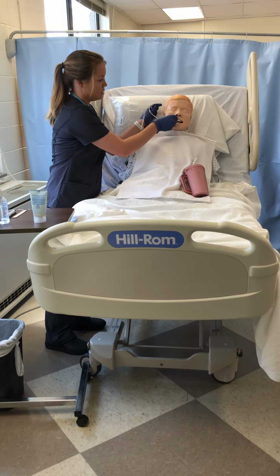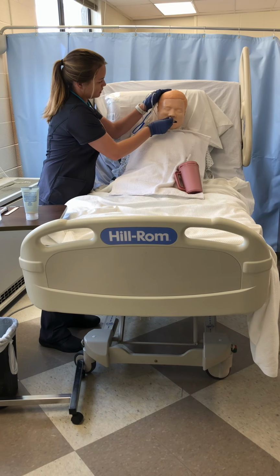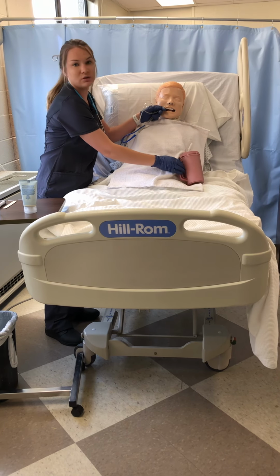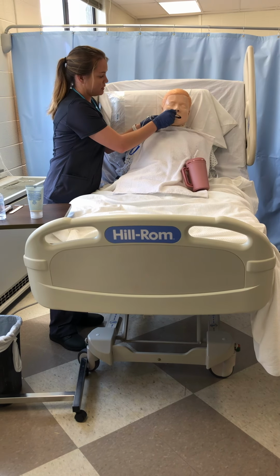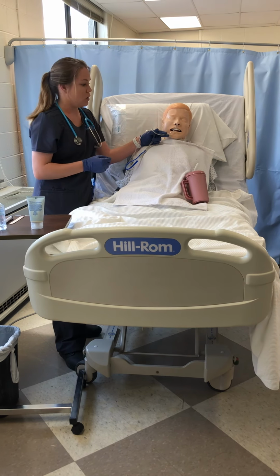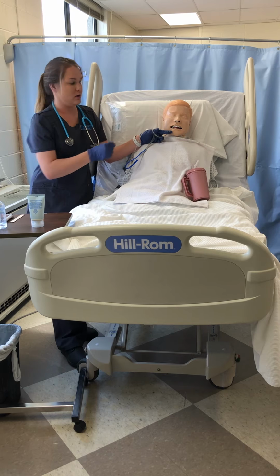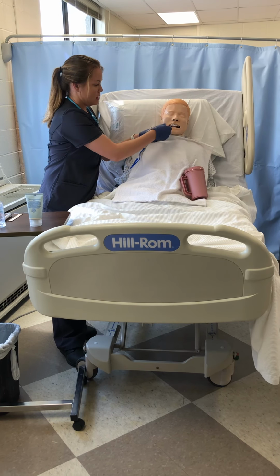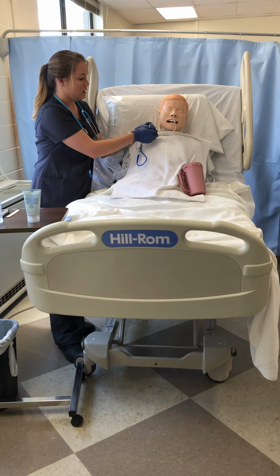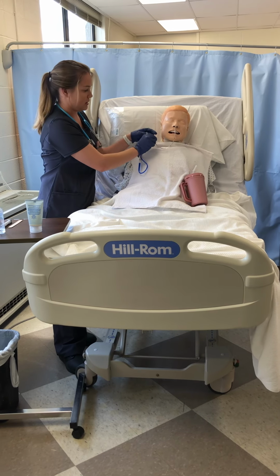And once I pass the nasopharynx, I'm going to put his head down, have him take some sips, and I'm going to advance it 2 to 4 inches with each sip. And if I meet resistance, I would withdraw it, lubricate it, and try the other nostril. And you would insert it until your tape, which is at 55, but because the mannequin doesn't allow this, I'm going to stop right here.